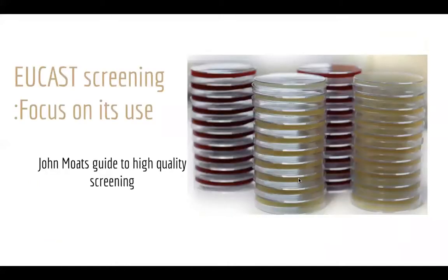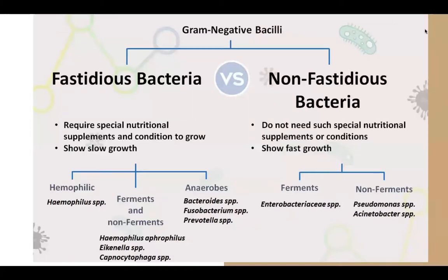So we're now looking at the EUCAST screening and focus on its use. This guide was made by John Moat, and he has some interesting insights about what you might find, for example resistant colonies in your samples. Some of his own techniques he's used, and I talked to him for many hours through this, so this will be quite interesting. Now, if you're a novice, something interesting to say before we continue is that we've got two types of bacteria when we're talking about these tests.